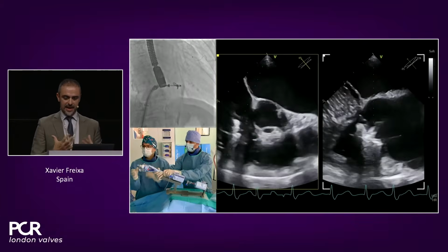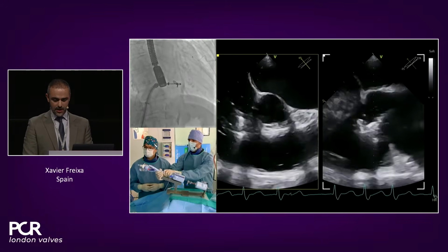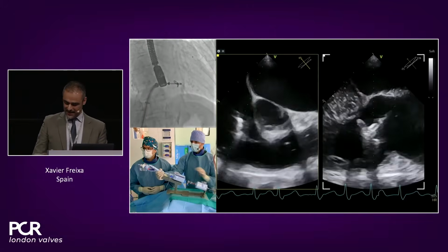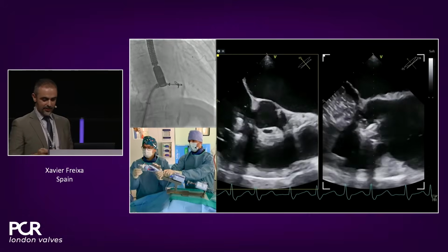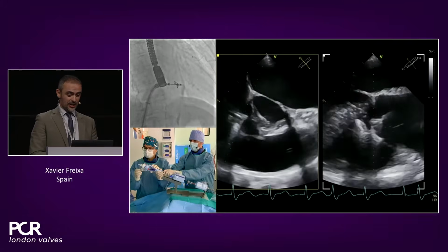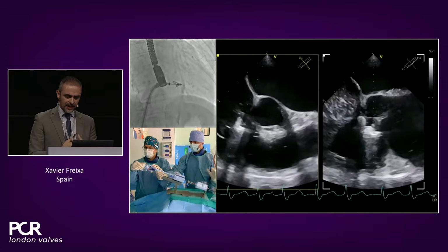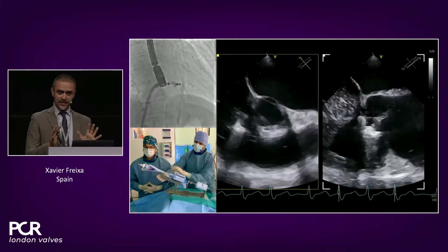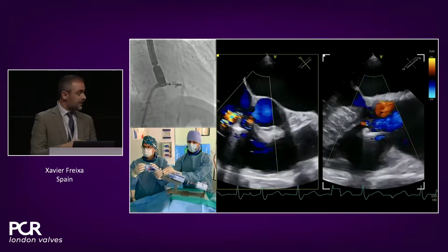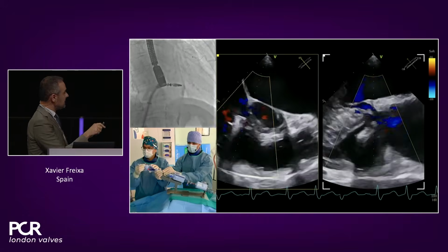And then it's the grasping time. I like this explained view where we see the inflow-outflow and the grasping view, where you can see that the septal leaflet here up is clearly sitting over the arm of the triclip, and then the anterior probably. But there's no rush. Here we're going to check before closing. Here we close a little bit, and the orientation is good. It's a procedure that you don't have to rush at all. You can check anytime, and once you're sure that you can see the lateral, in this case anterior leaflet, is in, you can close it.